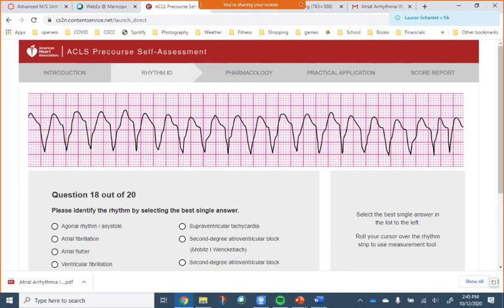That is definitely a V tach, because it's exactly the same. So Lauren, fibrillation is completely unorganized. There's no rhyme or reason to it. This one looks exactly the same. It's marching out beautifully like little soldiers. They're just wide, weird soldiers.